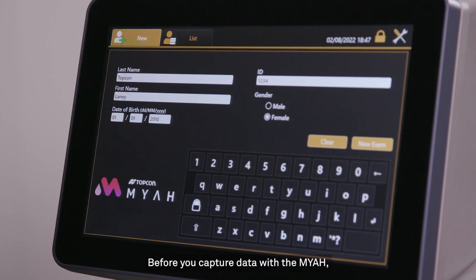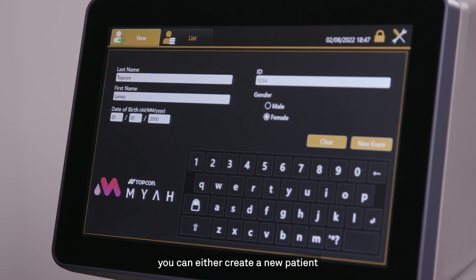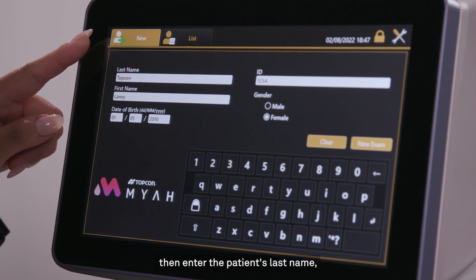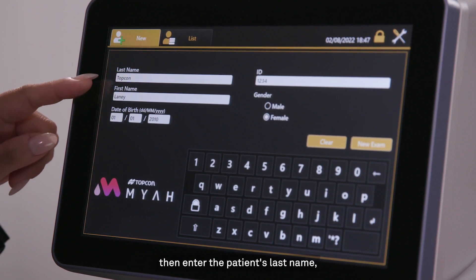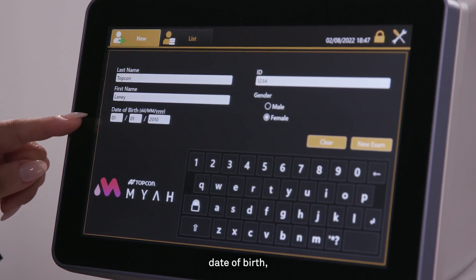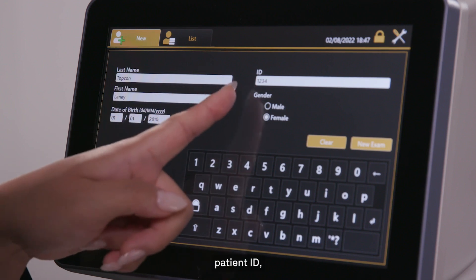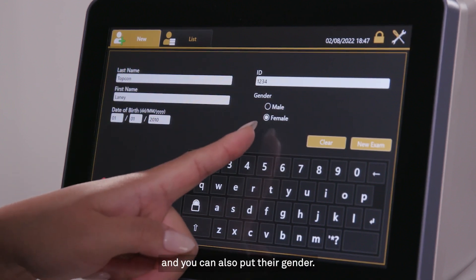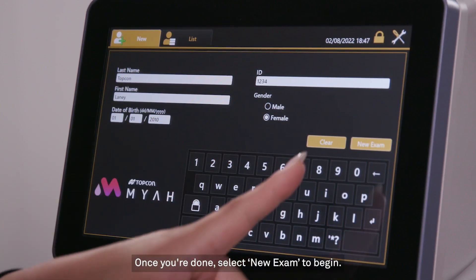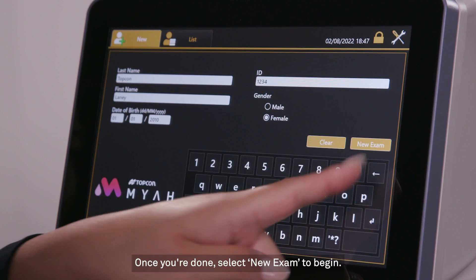Before you capture data with the Maya, you can either create a new patient or select an existing one. To enter a new patient, make sure you're under the New tab, then enter the patient's last name, first name, date of birth, patient ID, and you can also put their gender. Once you're done, select New Exam to begin.